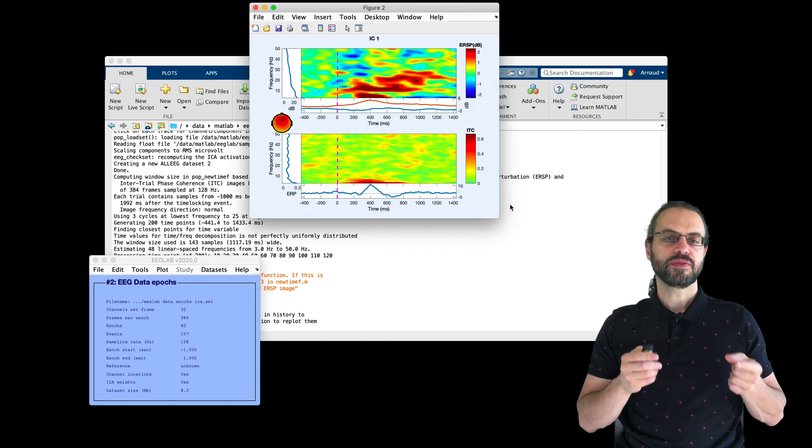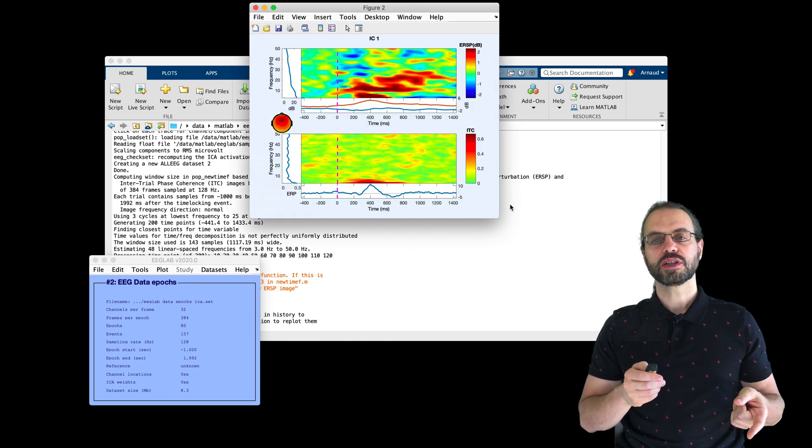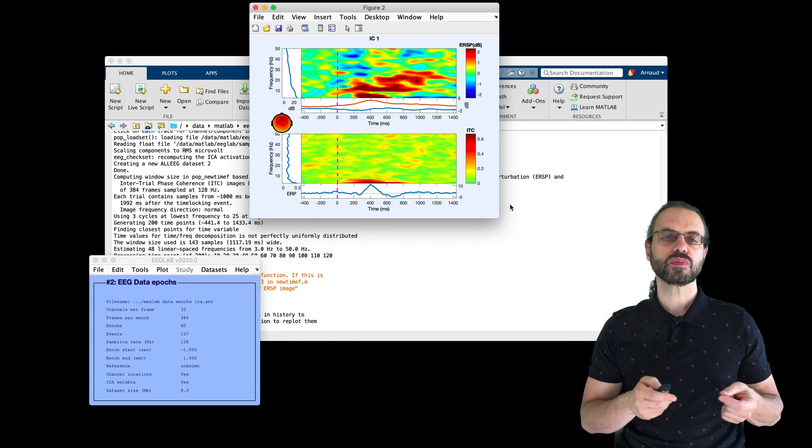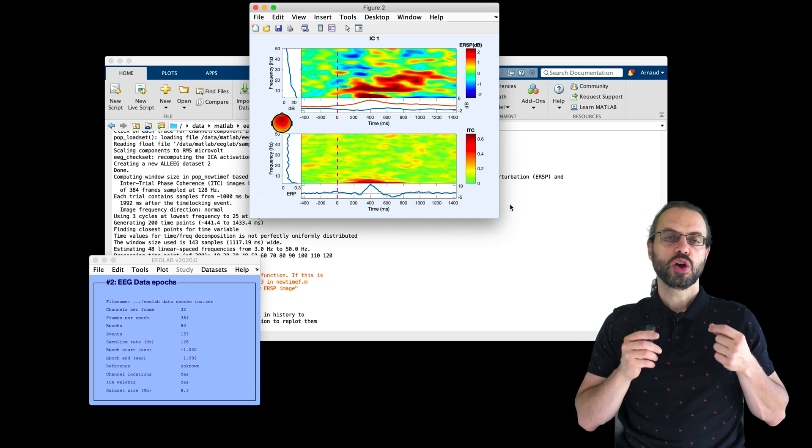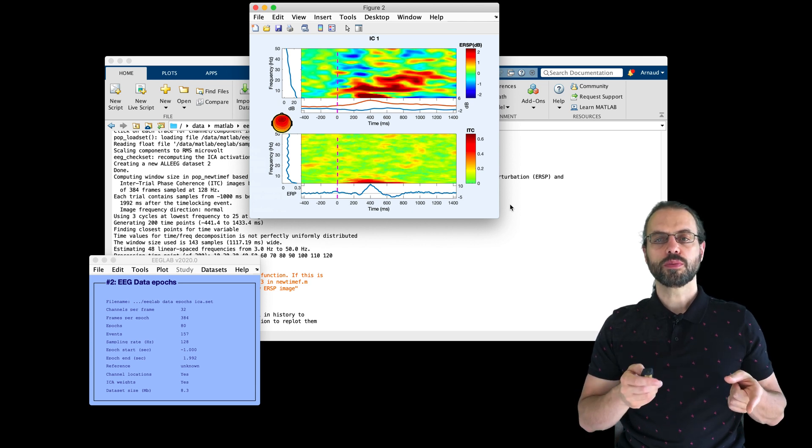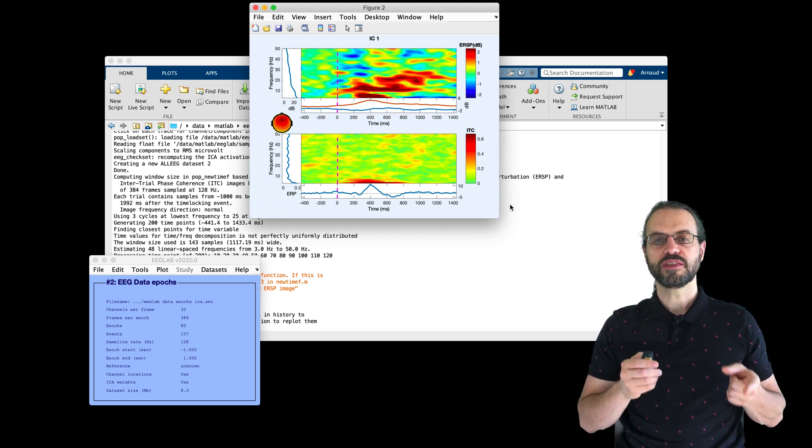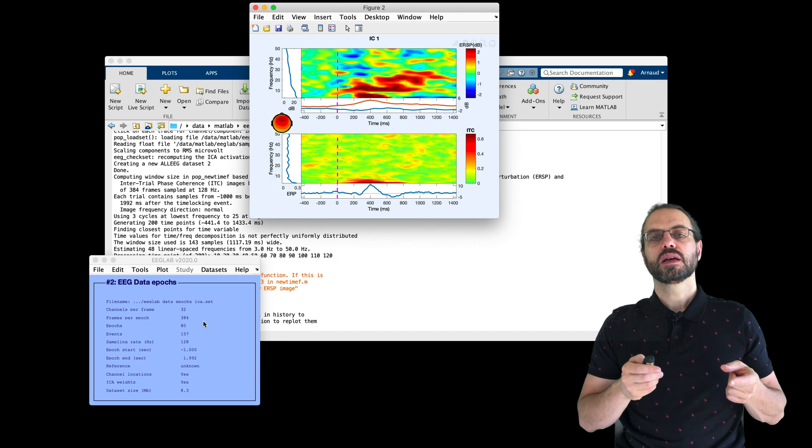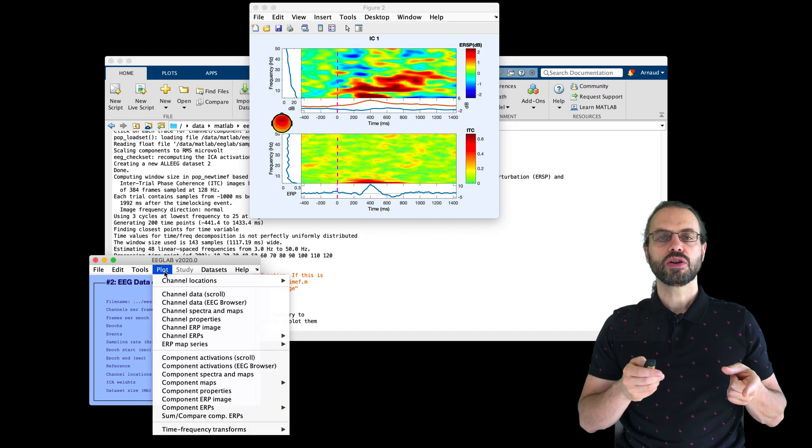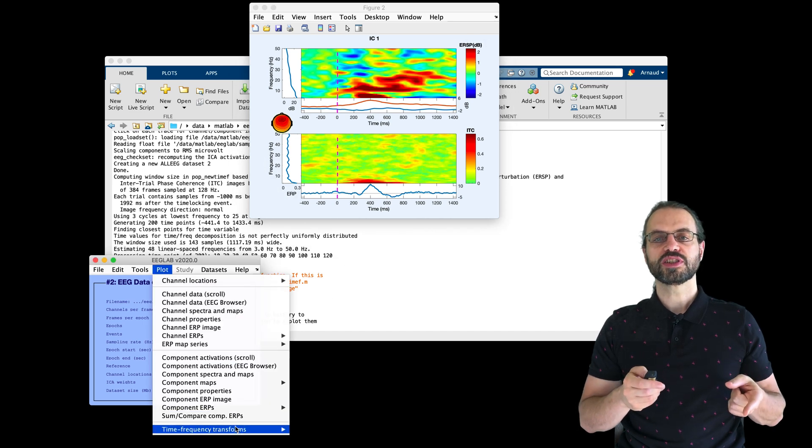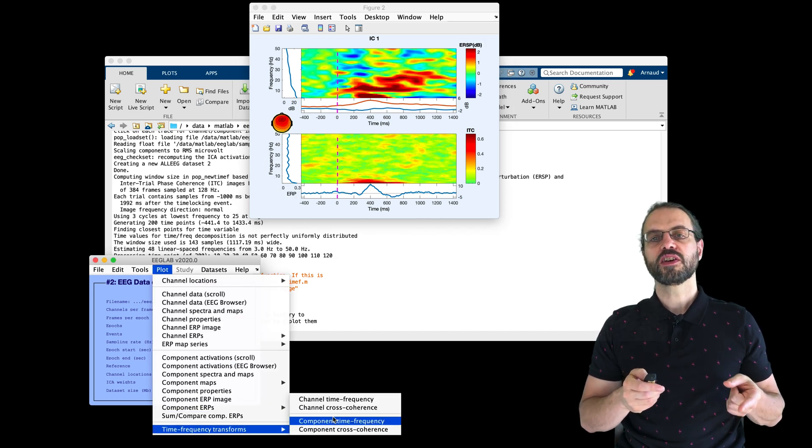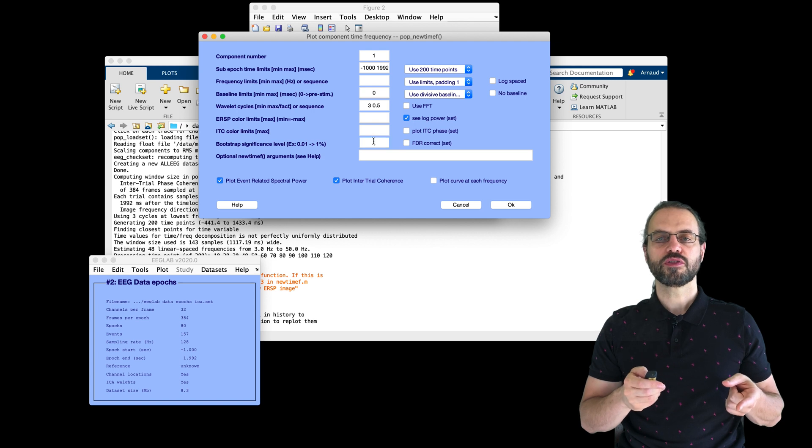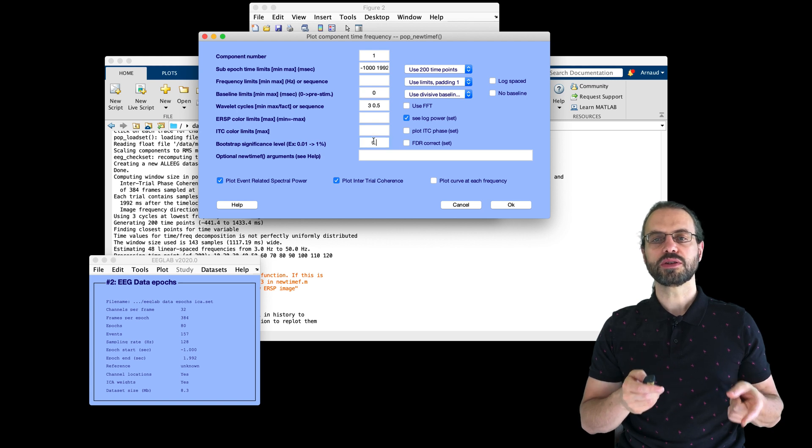So I press OK. And this is the time frequency decomposition for component 1. We can also mask for significance here at 0.05 with false discovery rate correction for multiple comparisons.